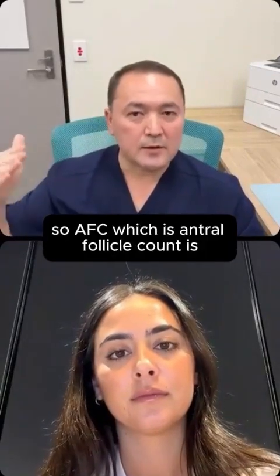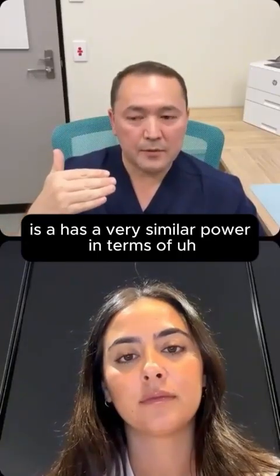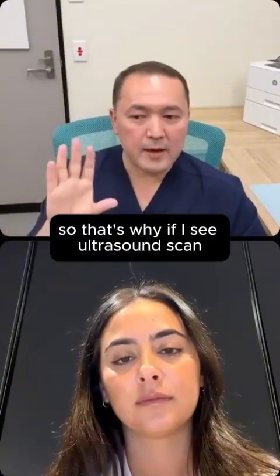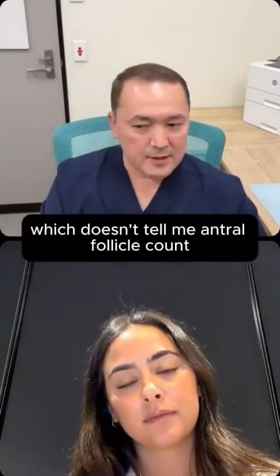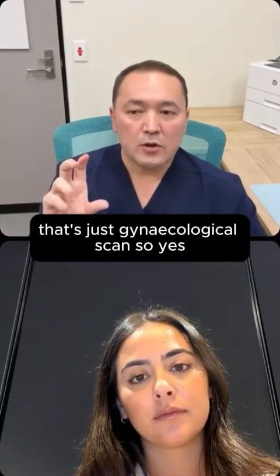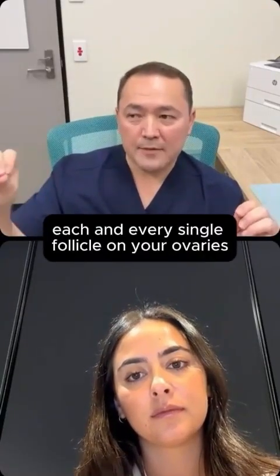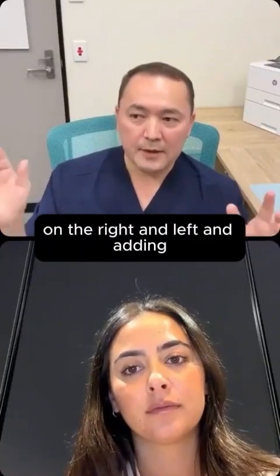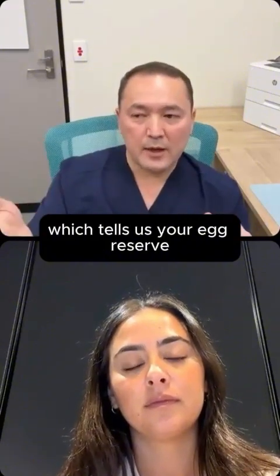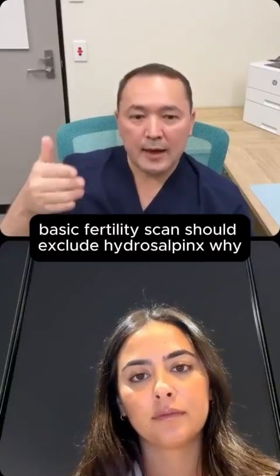It's the same as AMH. So AFC, which is antral follicle count, has a very similar power in terms of diagnosing your ovarian reserve as AMH. That's why if I see an ultrasound scan which doesn't tell me the antral follicle count, that's not a fertility scan, that's just a gynecological scan. So yes, an antral follicle count is measured and counted by measuring each and every single follicle on your ovaries on the right and left and adding the right and left antral follicle counts together, which tells us your egg reserve.